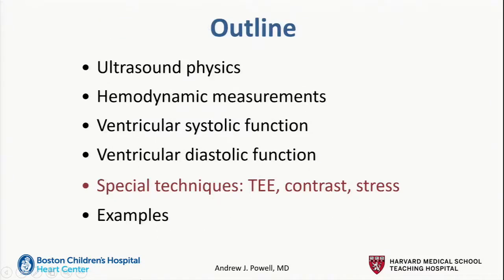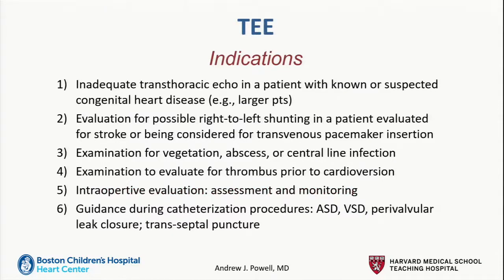All right. Let me go now to the next section of our discussion here on echocardiography. We're going to talk about special techniques. We'll begin with TEE. And I don't have any great way of going through the indications other than listing them for you, and I'll say them out loud just so you have a chance to hear them once. I think a lot of these will be intuitive for you.